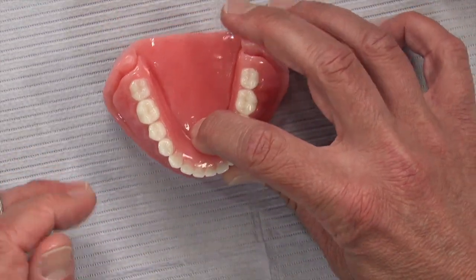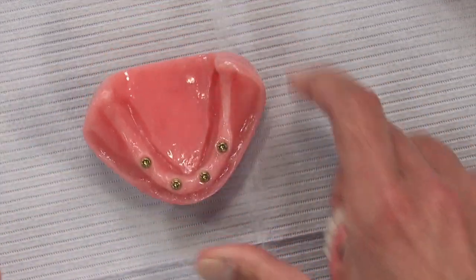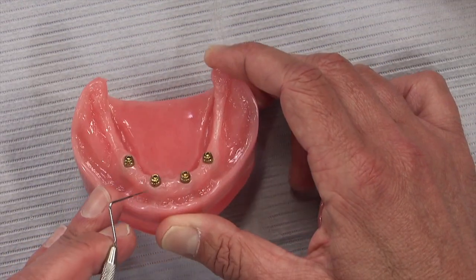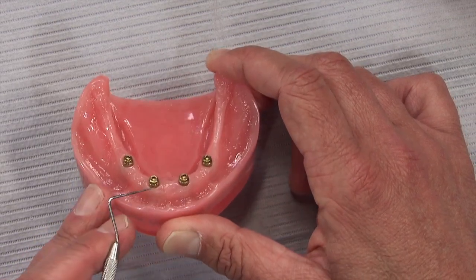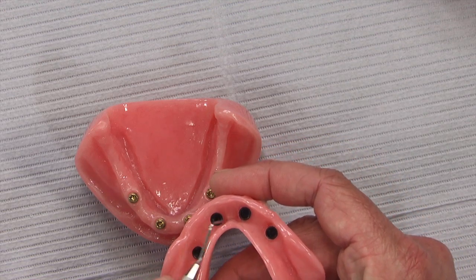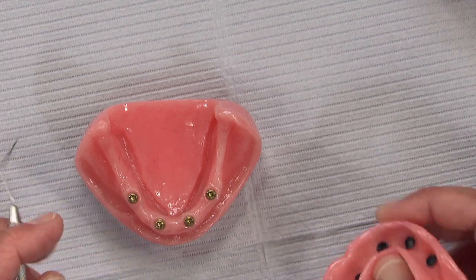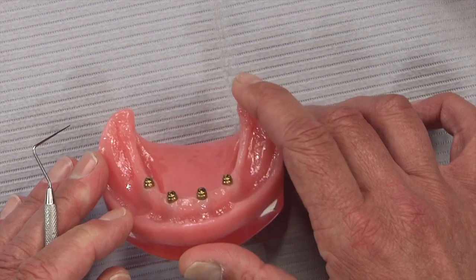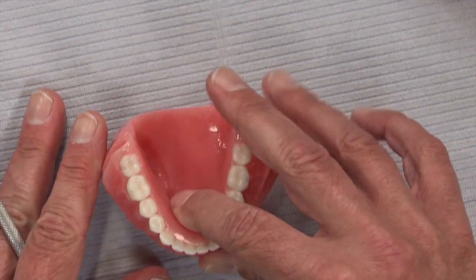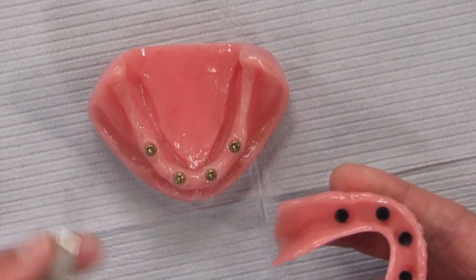Once hollowed out, try the denture back in the patient's mouth to confirm a passive fit — make sure you've removed enough acrylic so it isn't bumping into the locators. Once confirmed, place a white block-out ring, which is a small o-ring that sits right around the locator abutment to prevent resin from flowing down around the implant during relining. Place the white block-out rings, then take the black processing cap and seat it down on top of each ring. Try the denture in one more time to confirm it still seats passively after adding the small amount of vertical height from the black cap.